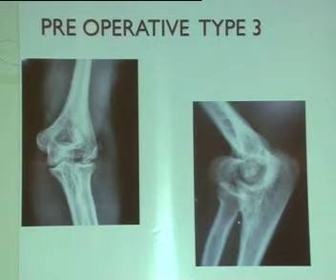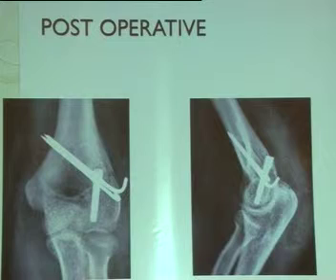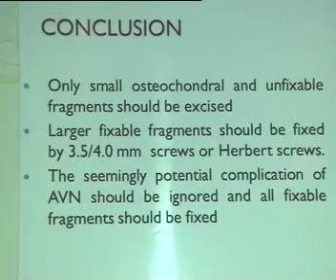Another case, a large fragment, Herbert screw and K-wires. Only small, I may conclude, only small osteochondral and unfixable fragments should be excised. Larger fixable fragments should be fixed by 3.5 or 4 mm screws or Herbert screws. The seemingly potential complication of AVN should be ignored and all fixable fragments should be fixed.